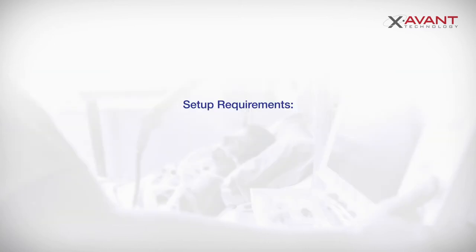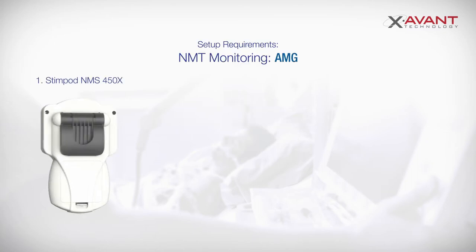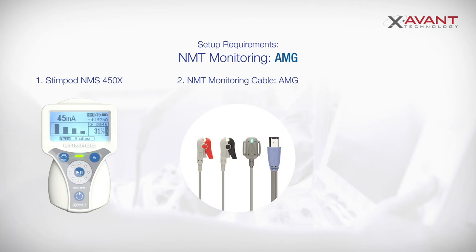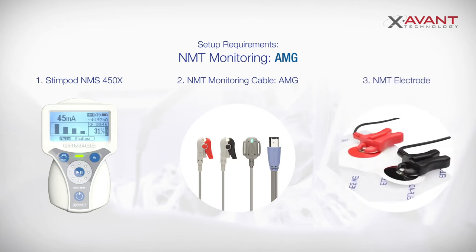Setup requirements. You will require the following: your Stimpod NMS450X stimulator, an NMT monitoring cable AMG, and standard ECG electrodes or the custom Xavant NMT electrode.